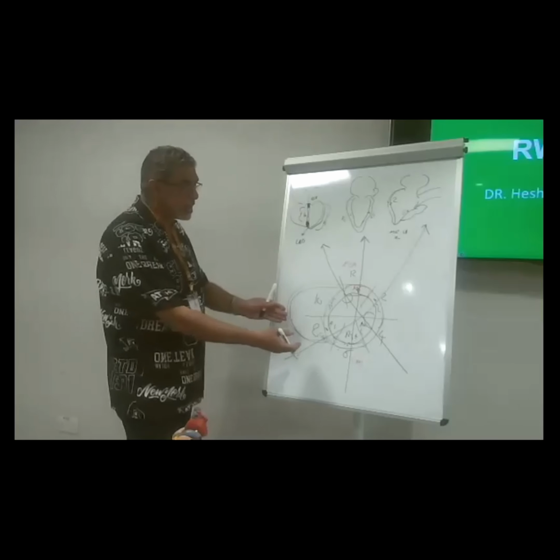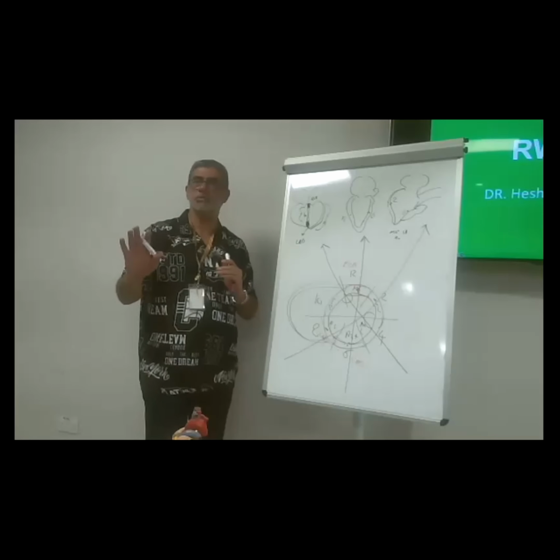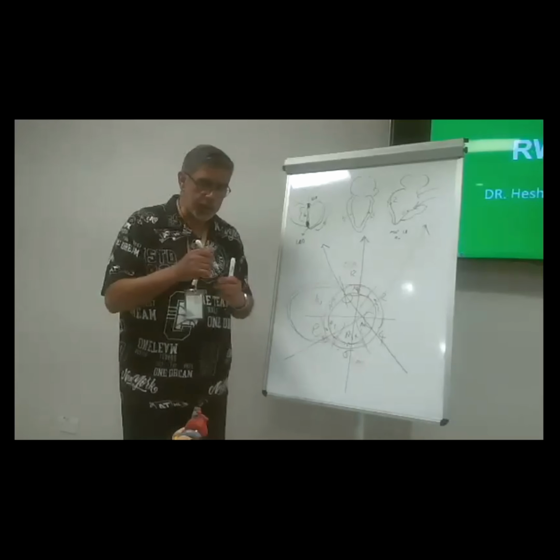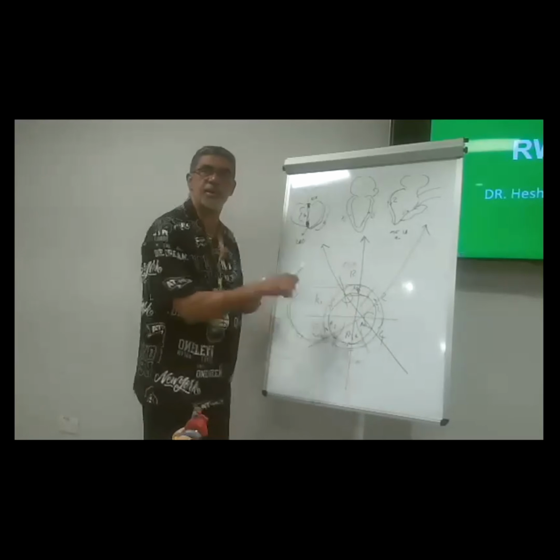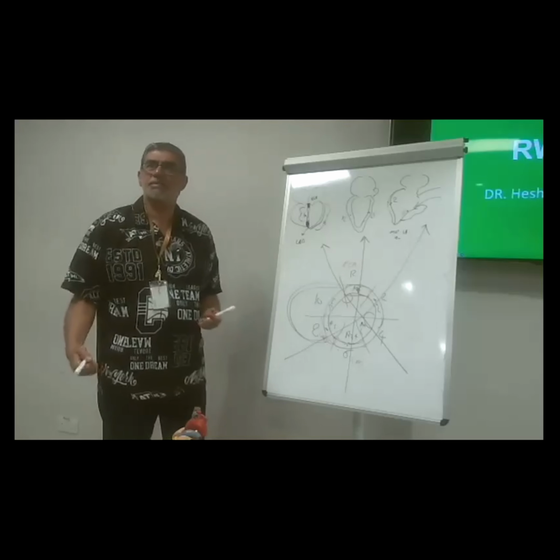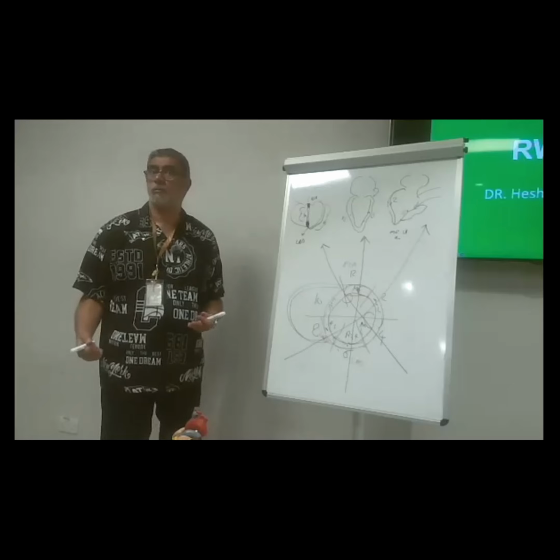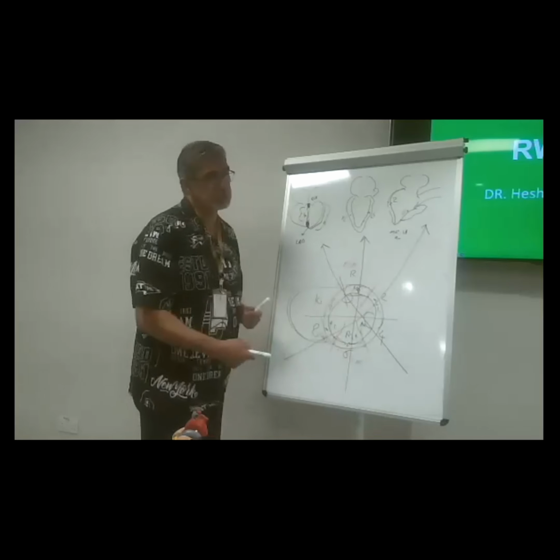That's why I take it into my consideration. Don't be confused. That's why I omit the other two. I told you 2, 12, 6, 8. Why do I use 8? Because it is pure. 2, 12, 6, 8. 2, it is not pure.